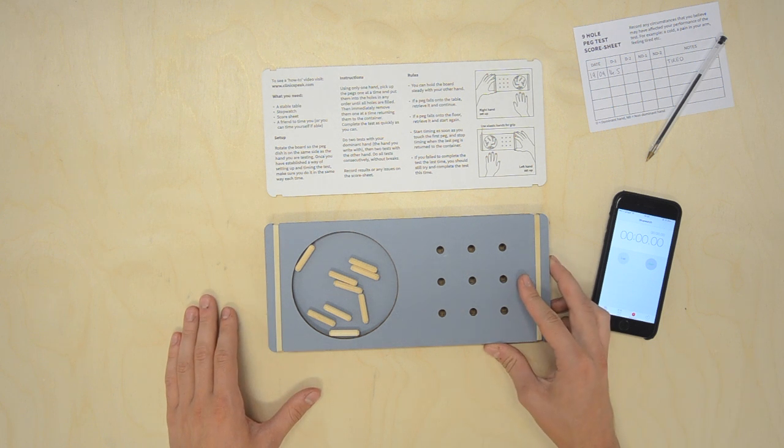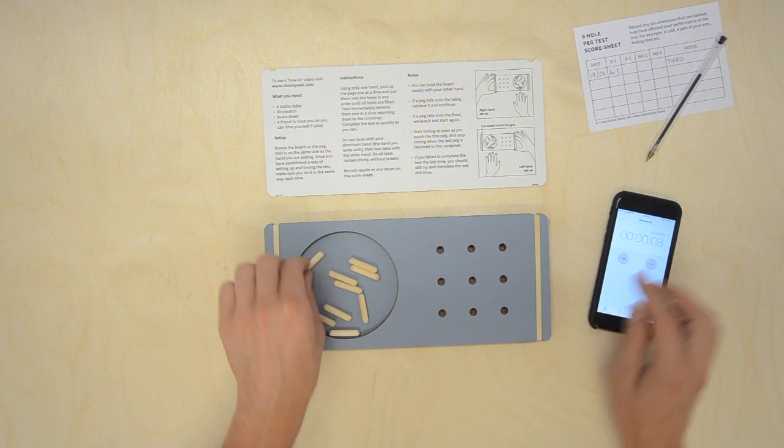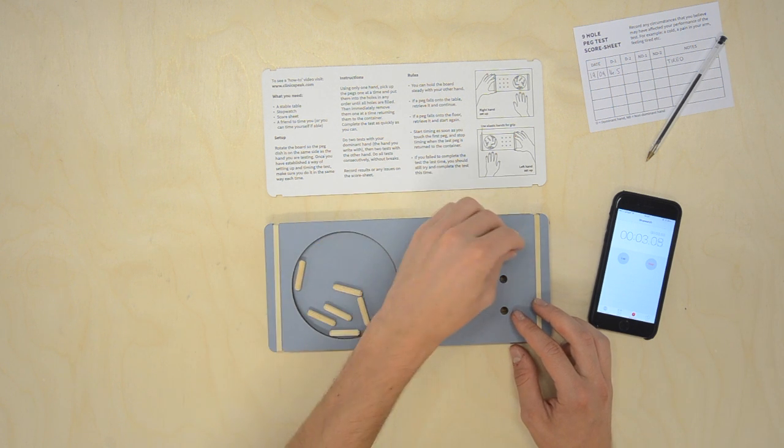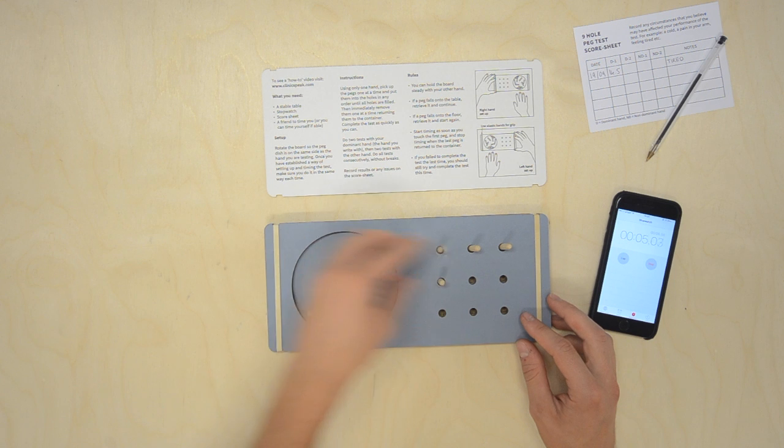You can hold the board steady with your other hand. Start timing as soon as you touch the first peg and stop timing when the last peg is returned to the container.